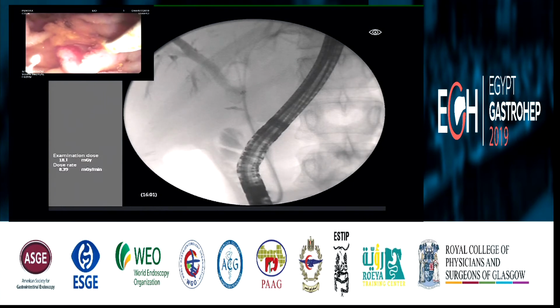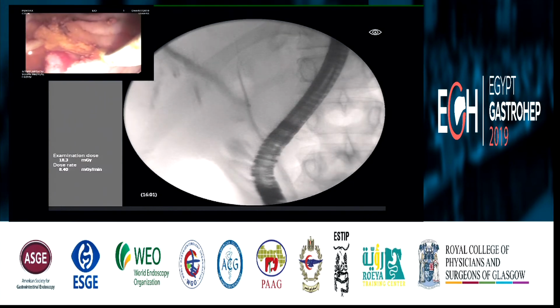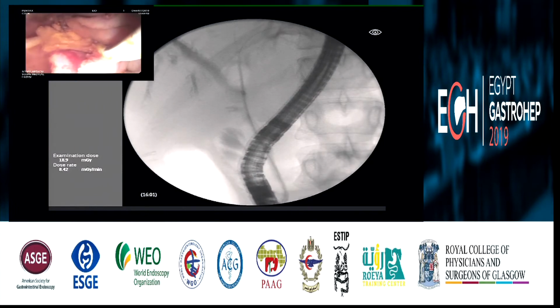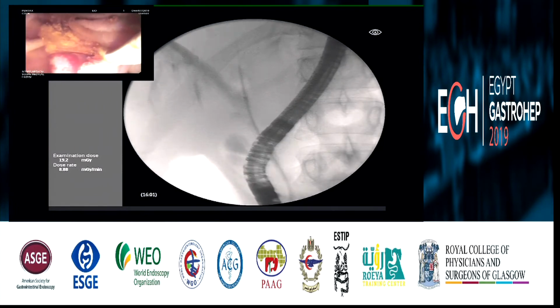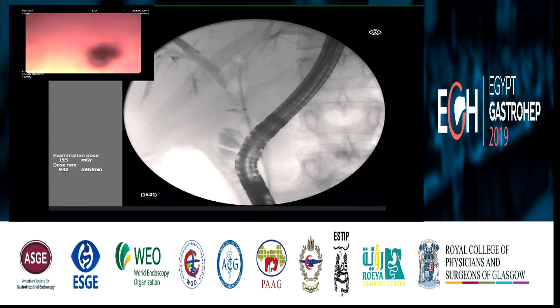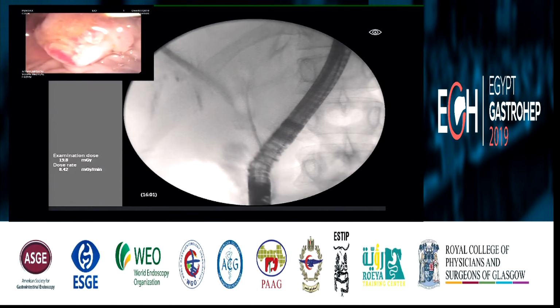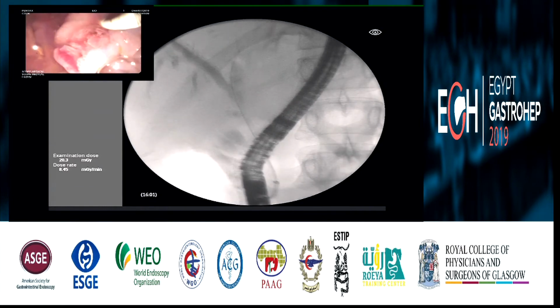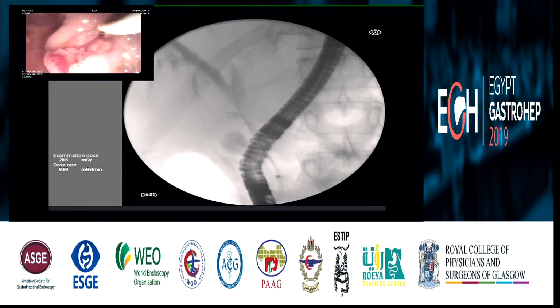This is a balloon inflated above the stricture. I just want to see if we can inflate the balloon. Yes, we are trying. Slowly, just a little. Stop. Okay, that's good. I just want to see if the inflated balloon can pass through. Okay, it passed.